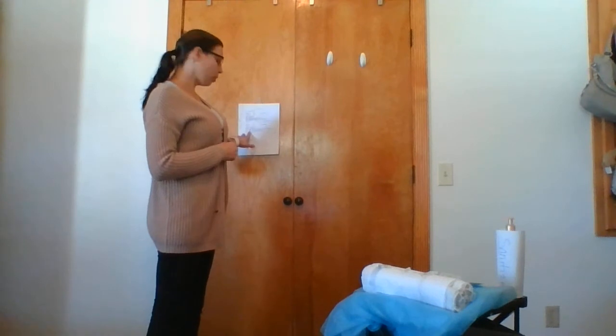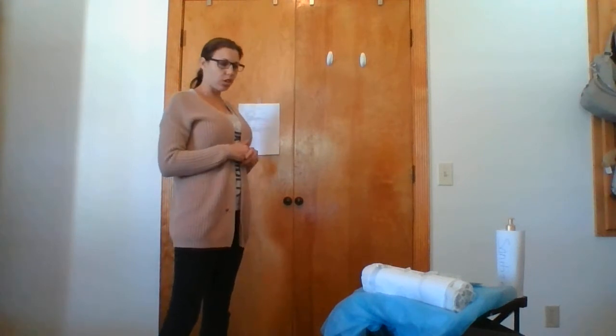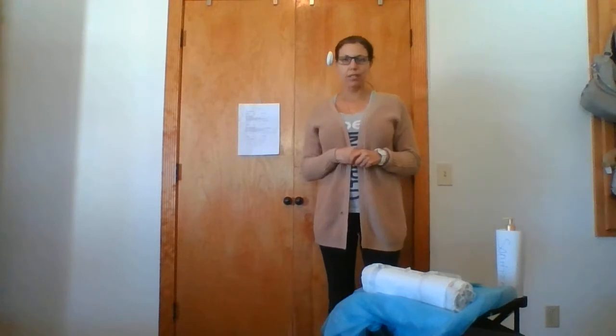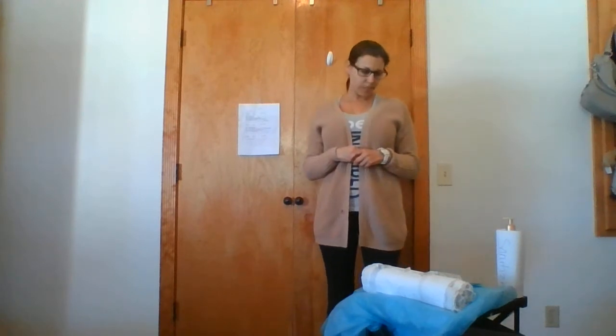So what I'm going to do is gather all my supplies, carry it to the patient's room, knock on the door, enter, and introduce myself. Good morning, Miss Davis. My name is Leslie, RN. I'm going to be administering your IV solution today.